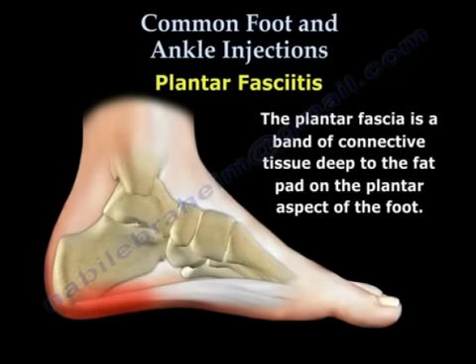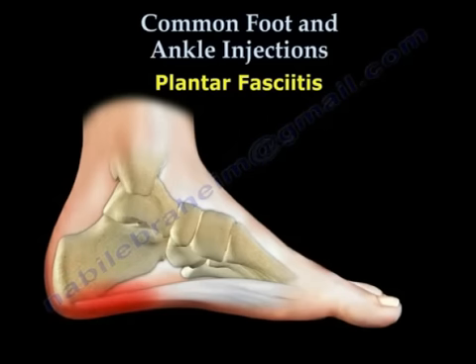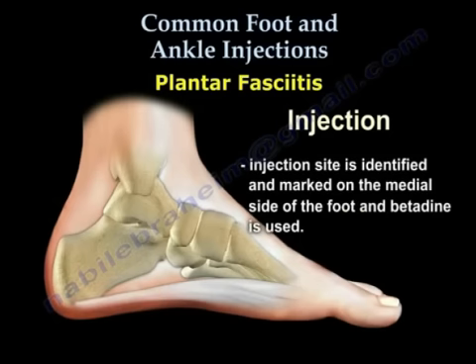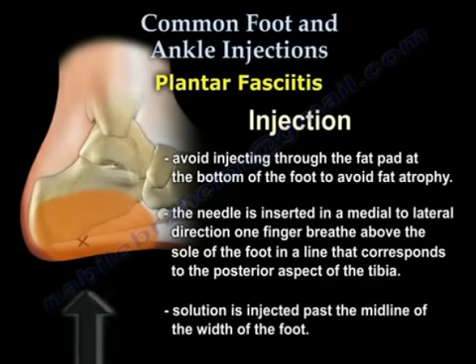Plantar fasciitis. The plantar fascia is a band of connective tissue deep to the fat pad on the plantar aspect of the foot. Patients with plantar fasciitis complain of chronic pain symptoms that are often worse in the morning, especially with walking. Injection site is identified and marked on the medial side of the foot, and betadine is used. Avoid injecting through the fat pad at the bottom of the foot to avoid fat atrophy.